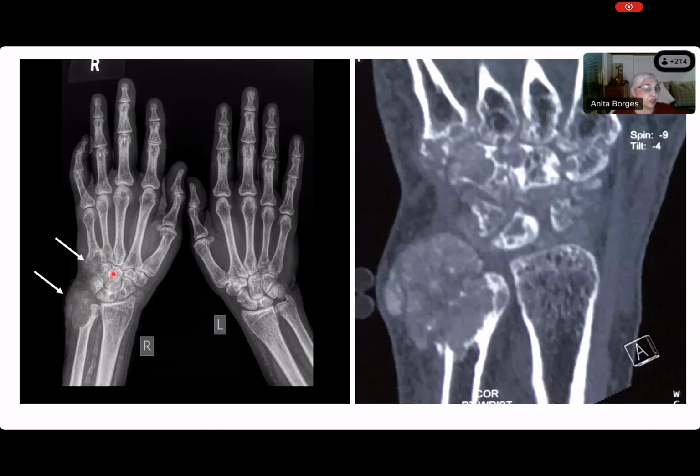And when you look at the other lesion, it is a little difficult to say whether the lesion has arisen in the bone or in the soft tissue. But as far as this ulna is concerned, there is no doubt that there is a large soft tissue extension, and it may actually be a soft tissue lesion that is scalloping or eroding the bone. So that's what we know when we look at this.